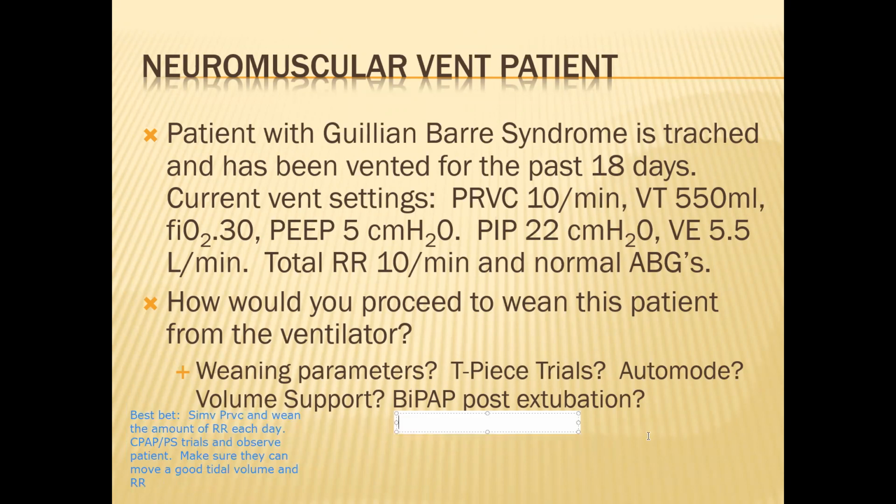Okay, and then problems with auto mode. And problems with volume support.